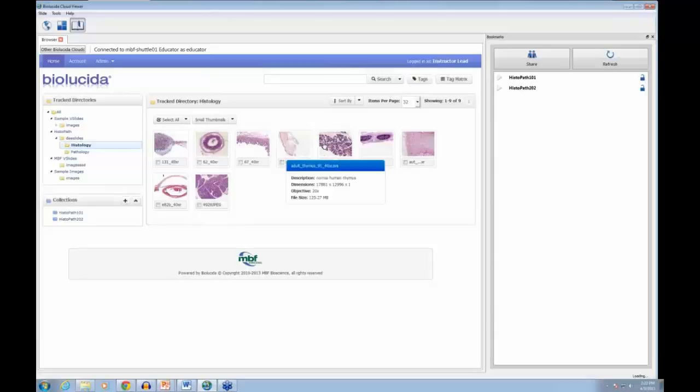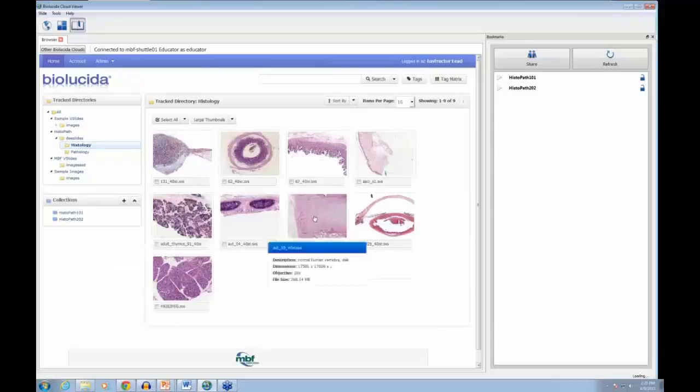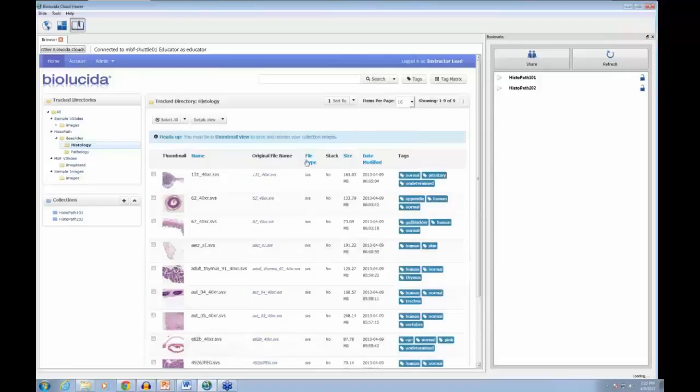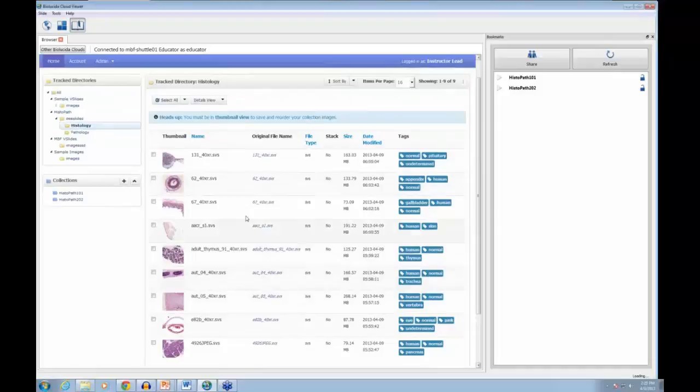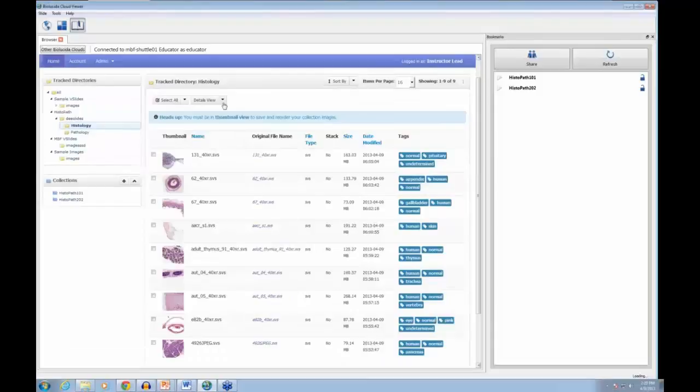As you navigate, a popup window tells you what the sample is, its dimensions, the objective used, and the file size. You can make the thumbnails larger if that's useful. There's also a detailed view showing image names and tags, which you can use to further organize your specimens.